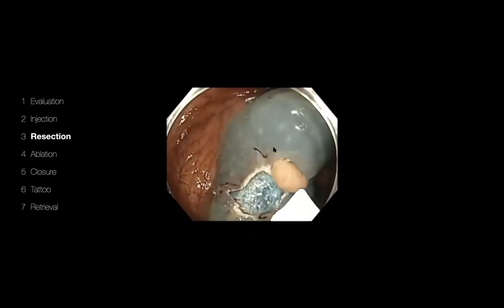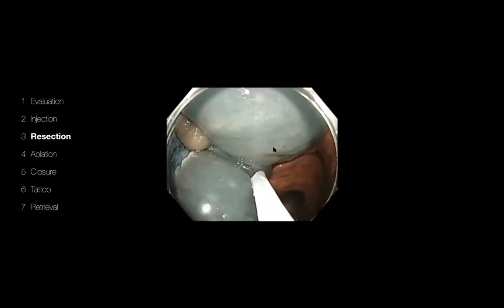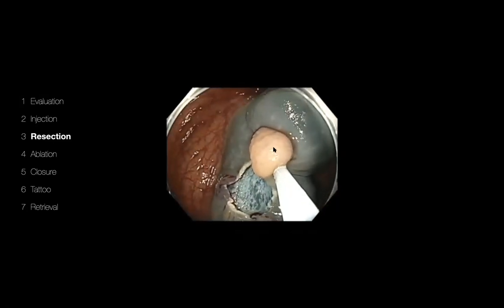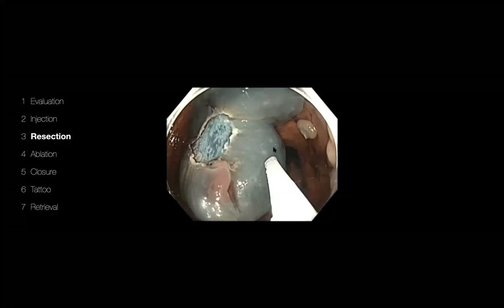Yeah, I think one thing that is very important is that as endoscopists, we should have a lot of patience in educating our team, so that over a period of time, both the assistant and the endoscopist work in sync. It's worth taking the time to educate everybody so that we don't have to instruct every single step as we do the procedure.